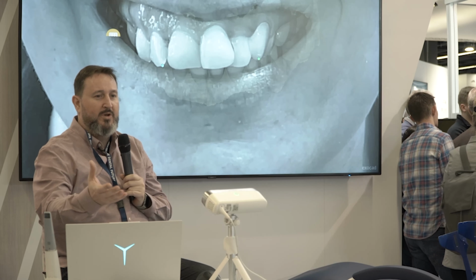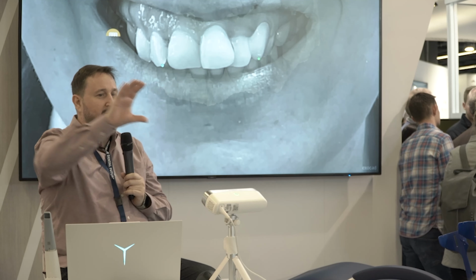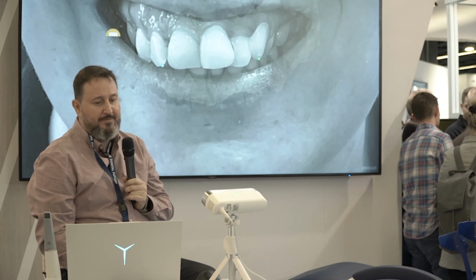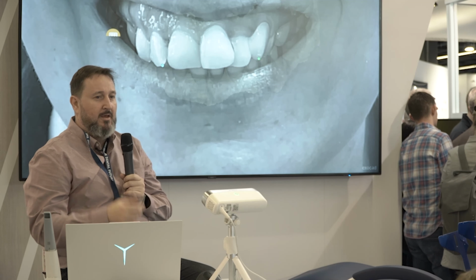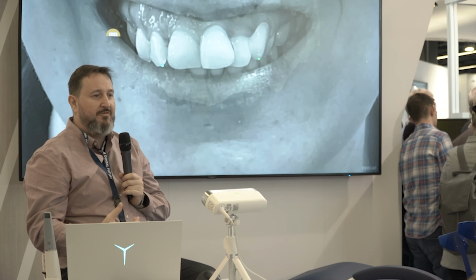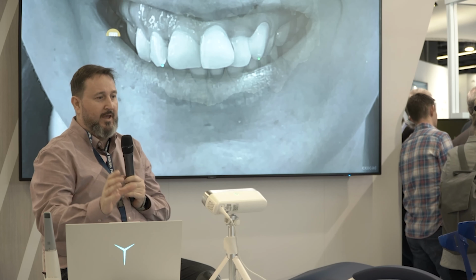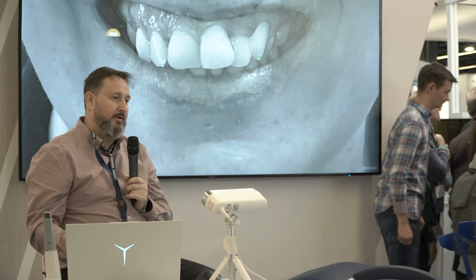We used to work with DSD. DSD is digital smile design. So, okay, we take a shot. This was made with a 4K camera, so we can choose different images, we can move it, and we can place it. One of the biggest problems when we work with images is that the focus that we are using is different than the software we are using. So the focal view is different, and the depth is different. So probably there will be a big misalignment.